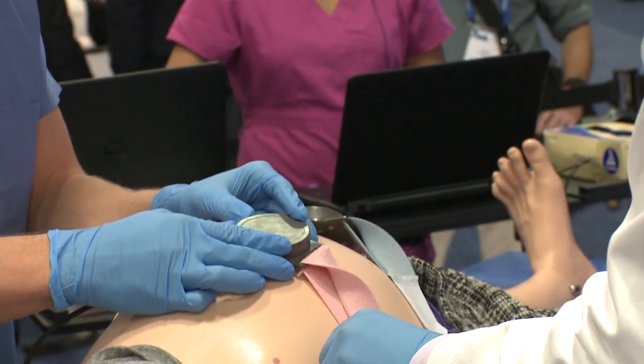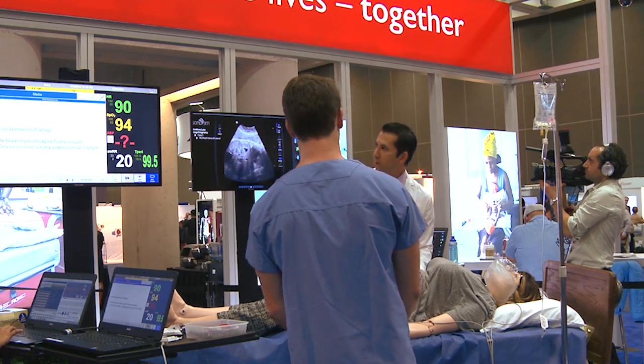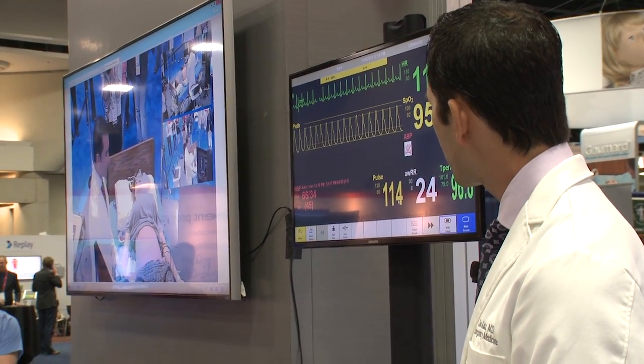At the same time we place the fetal monitor, putting on the tocometry to check for contractions and a heart rate monitor to assess the baby — that strip is displayed on the monitor, and the baby seems to be doing okay, though there are some decelerations. The obstetrician responds, and as a team they decide what's best for the patient. For our part, we have stabilized her airway, terminated the seizures, and used ultrasound to determine that this altered woman is altered because of eclampsia.